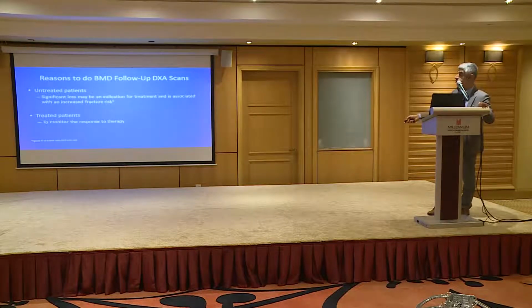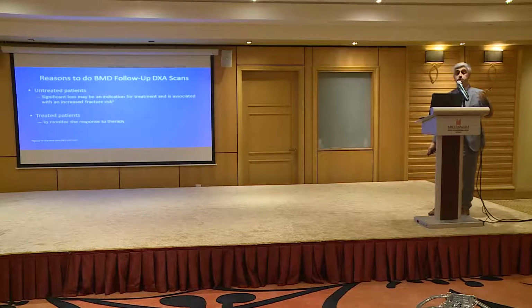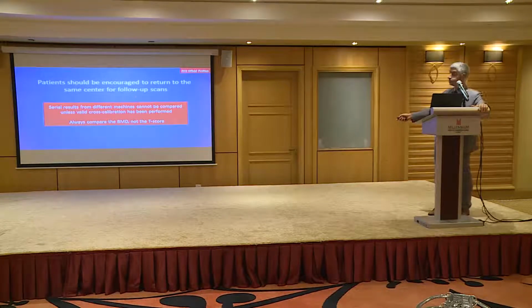In treated patients, you want to see the effect of your therapy. If you're giving an anabolic agent, you expect the density to increase. If you're giving an anti-resorptive, it would also increase, but it could also stay stable, maintaining the bone density they have. Patients should be encouraged to return to the same center for follow-up scans, as we mentioned in the beginning. We don't like to compare DEXA scans from different technologies. We'd like to do them in the same place.